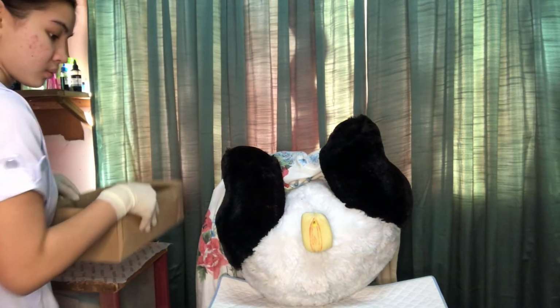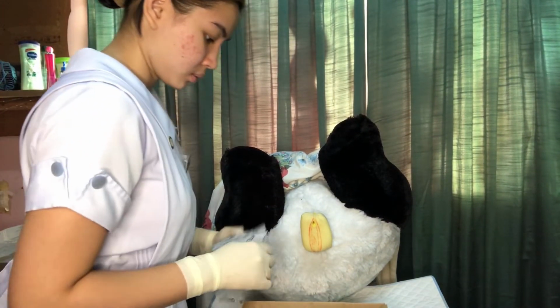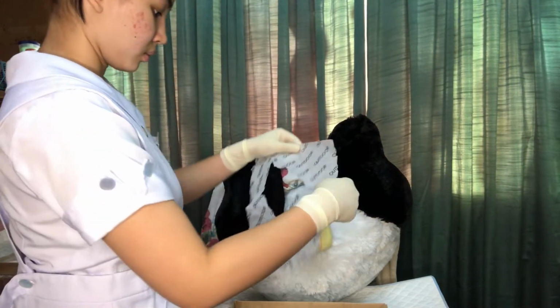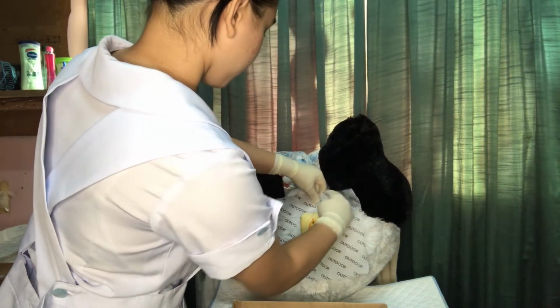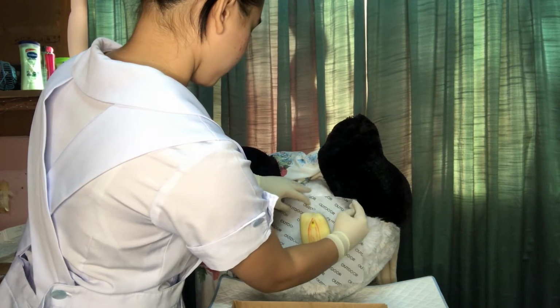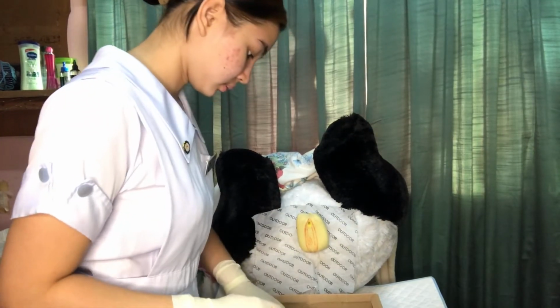Here I place the sterile tray on the drape between the client's thighs so I will have easy access to the materials, and I also put a drape on the vagina where I will clean the labia minora so the fluids will not go around her genitals.